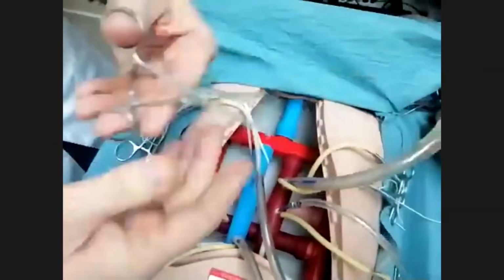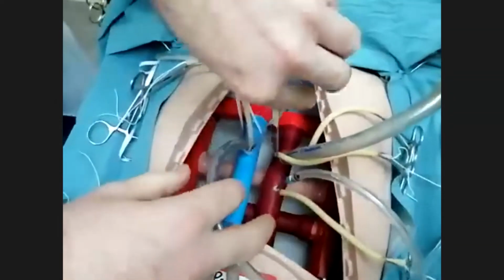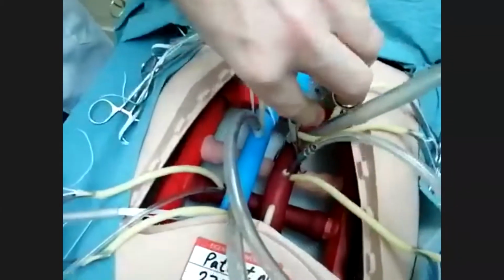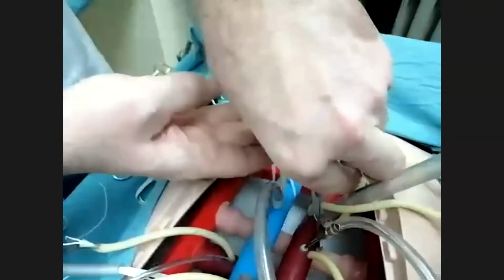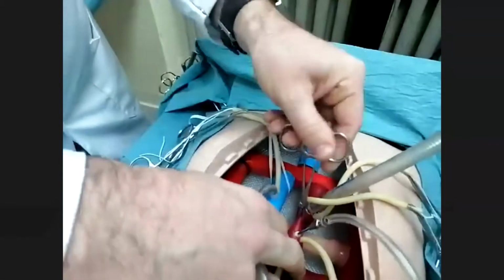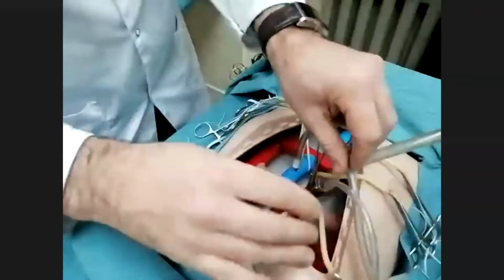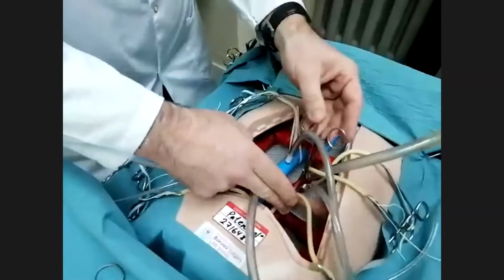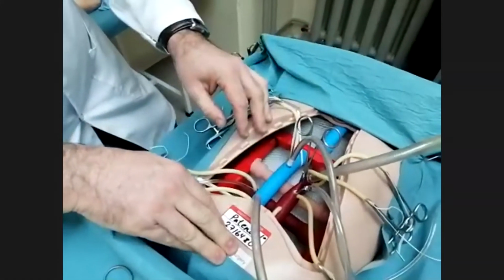I take the clamp in my left hand, and then I should ask the perfusionist to stop the perfusion. Okay, cross clamping, begin perfusion, and the main step of the surgery, the open heart surgery, is beginning.